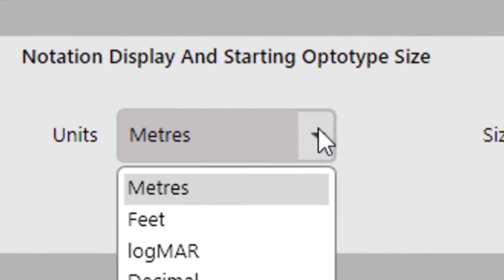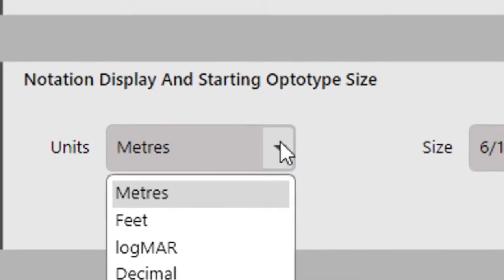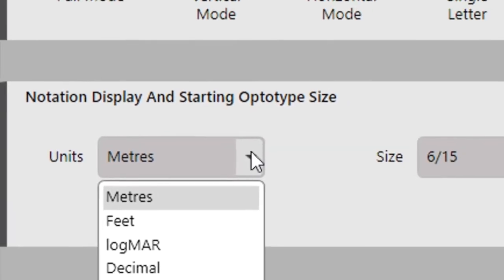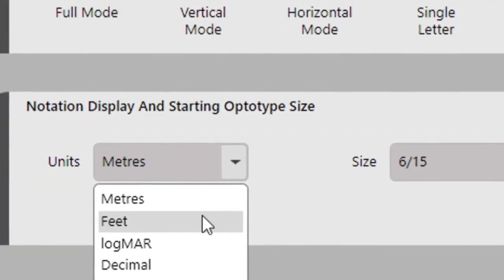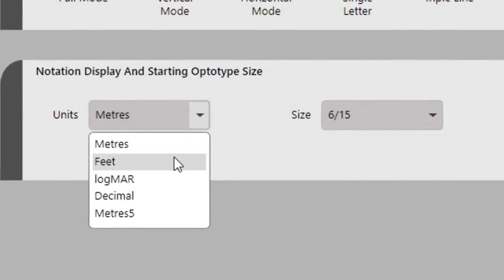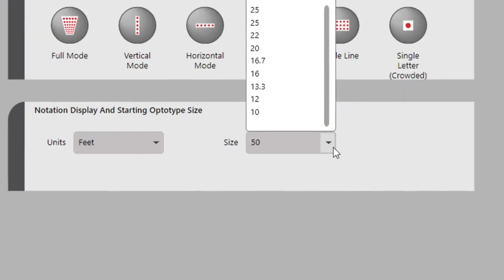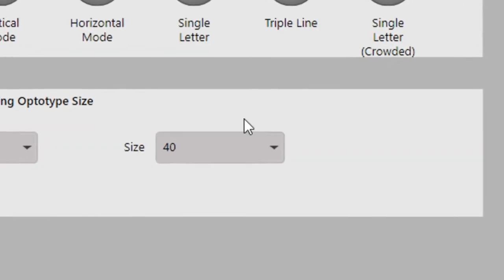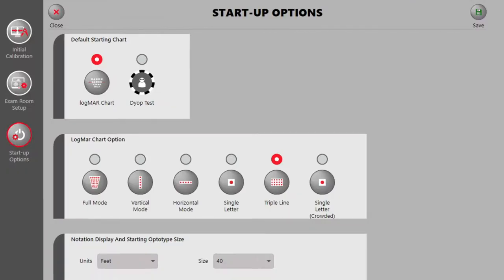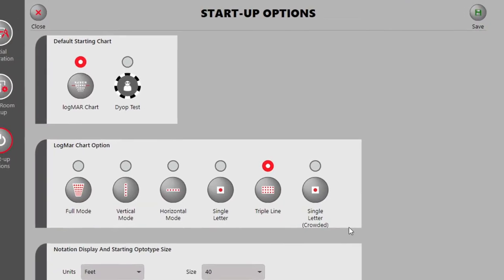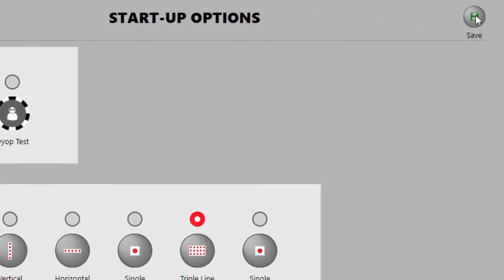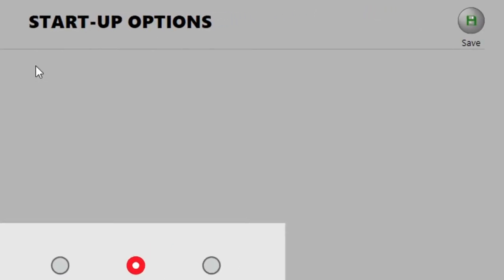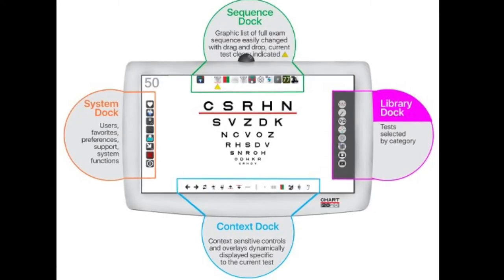Next, select your notation preference — feet, meters, or decimal — that will be displayed on all your charts. You can also select the starting size optotype in the selection box next to the choice of optotype. Press the Save button on the top right-hand side and you are ready to start refracting.